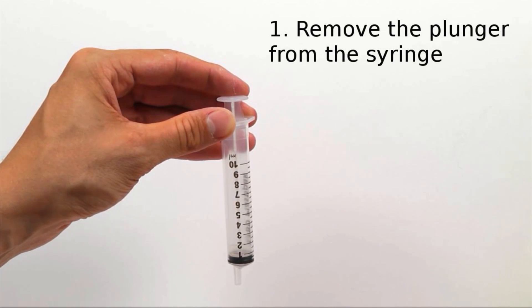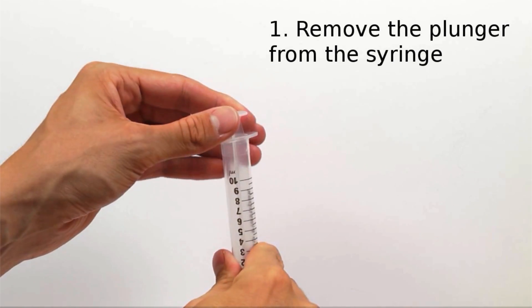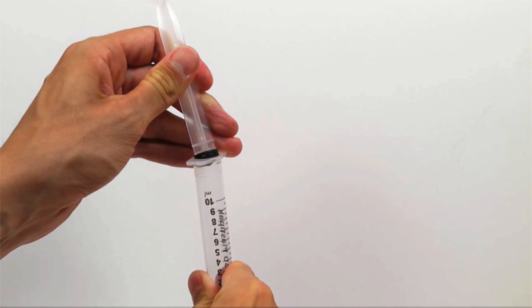Get a stopwatch and some 10ml slip tip syringes. Remove the plunger from one syringe and discard.